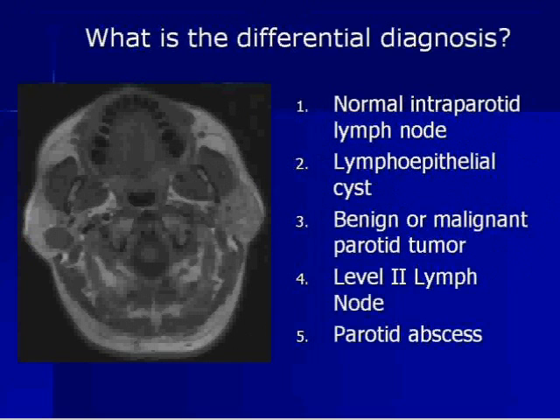So what's the differential here? Is it a normal intraparotid lymph node? Is it a lymphoepithelial cyst? Is it a benign or malignant parotid tumor, a level 2 lymph node, or a parotid abscess?